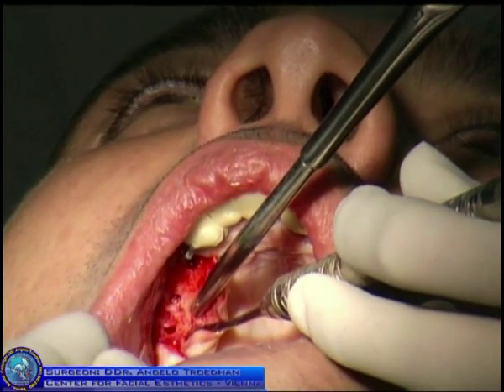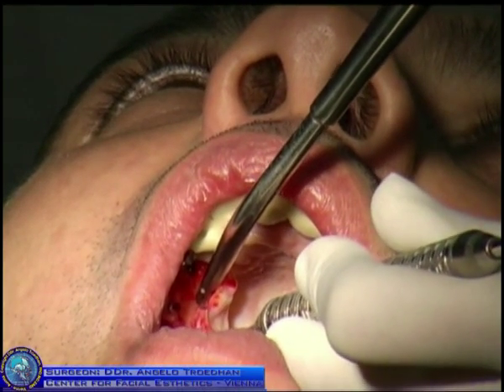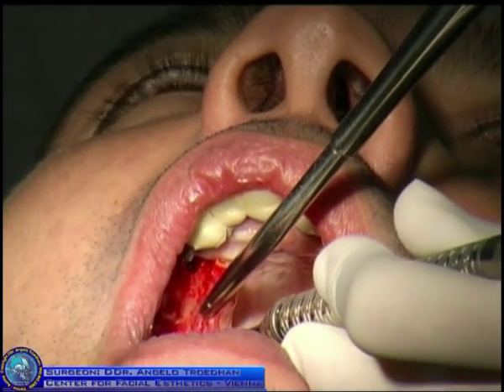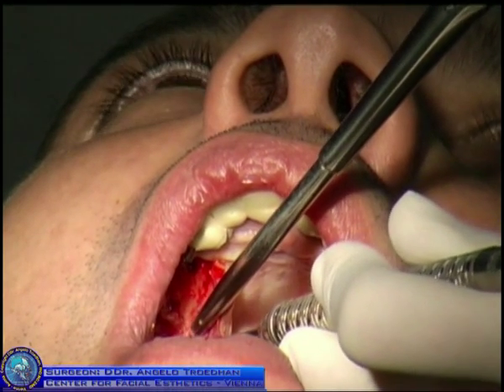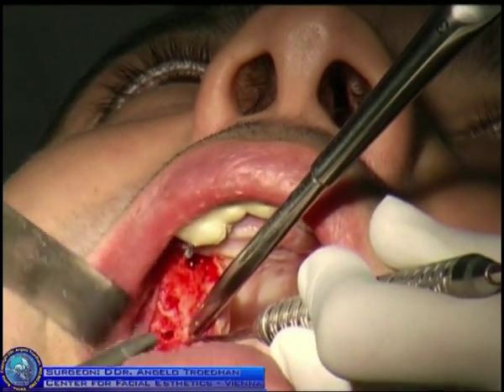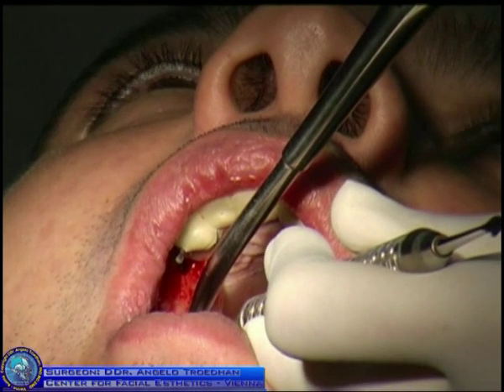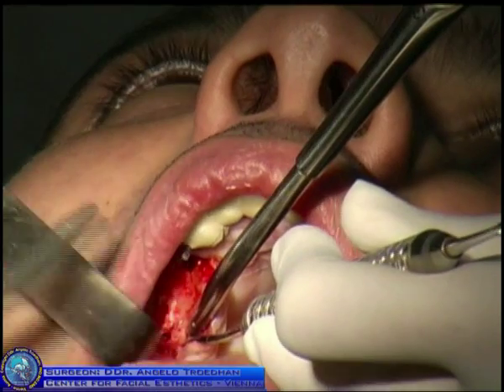And this of course now is a very time consuming process. But when we developed the entire method, we didn't have this one, an amalgam syringe. And this procedure took half an hour, 45 minutes or so.